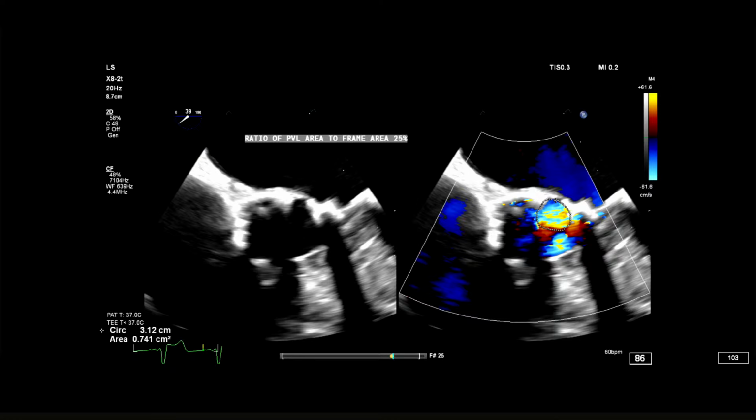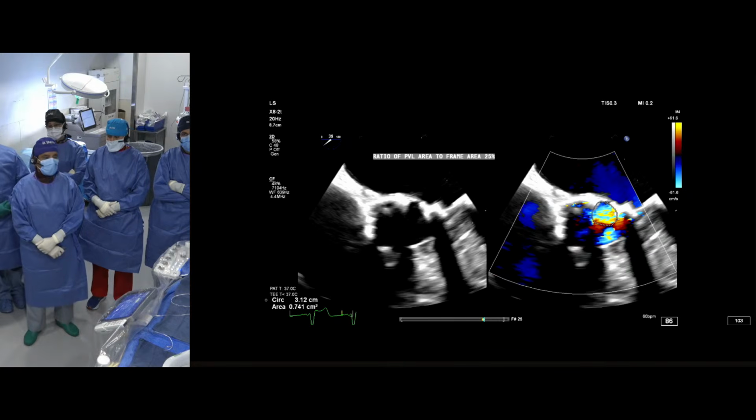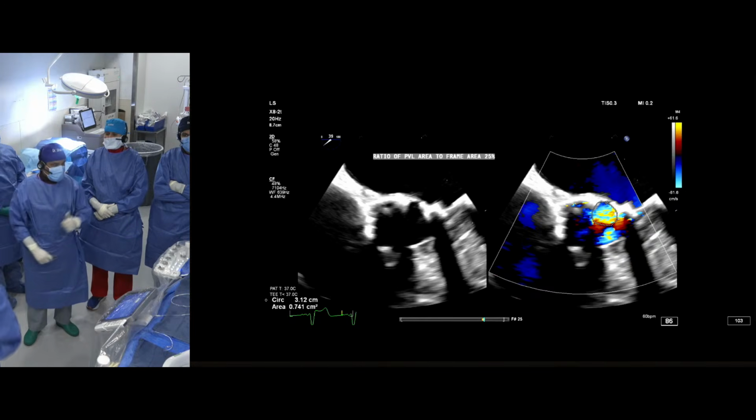So in this case, everything is close to moderate to severe. So it looks severe. Okay. So clearly the question then comes back: at time 0, we still had a PVL. It was mild, never minimal or 0. Could one plug it at that time or at follow-up? We'll ask Sahil on that.